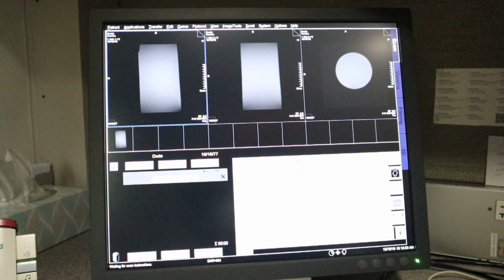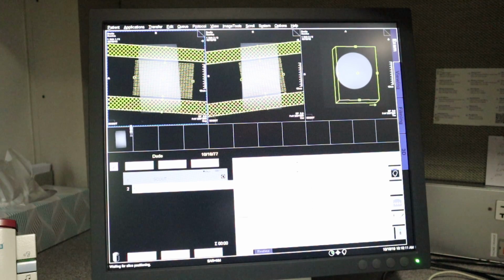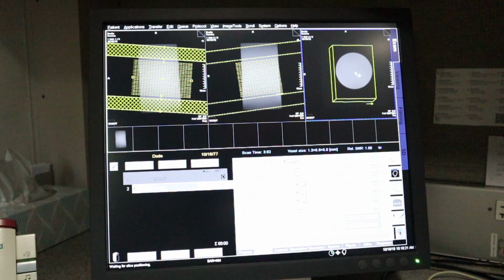So now we're going to set up, let's say, the axial FLAIR. So we're going to do an axial FLAIR. So we're going to open the protocol. And that's going to show us all of our sat bands and all of our slice groups, etc. Center that up just a little bit better.